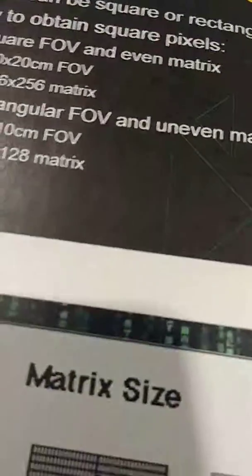So if I swapped my phase and frequency, and I set up a rectangular field of view, what's now going to happen? Can't you get wrapped? They cut off your anatomy. Why? Because it's going to shrink in the phase.